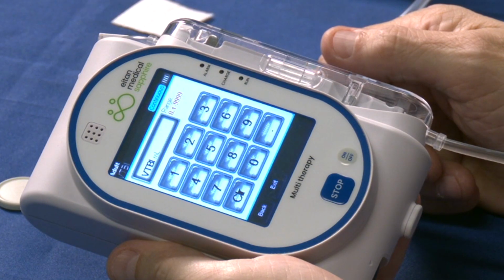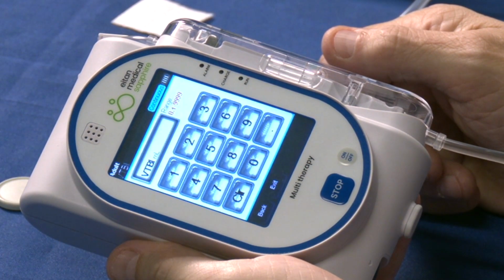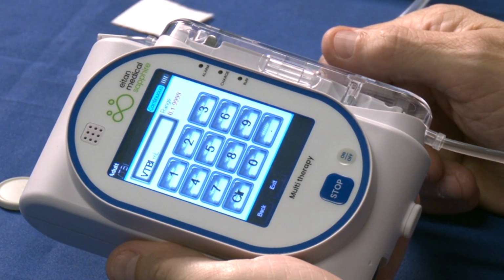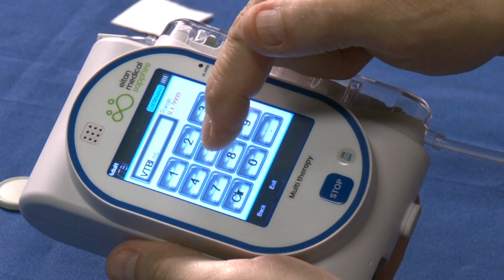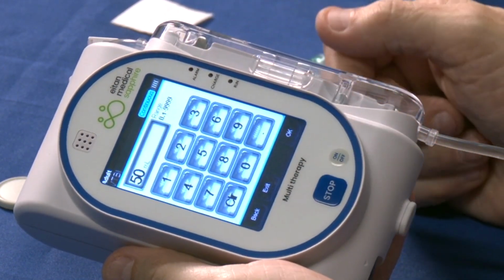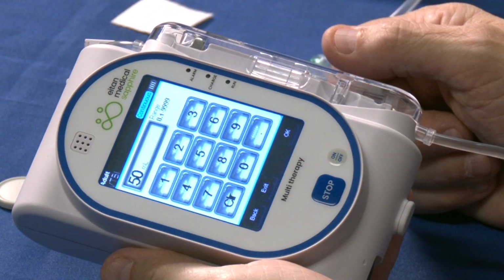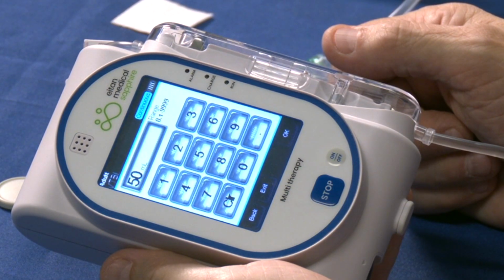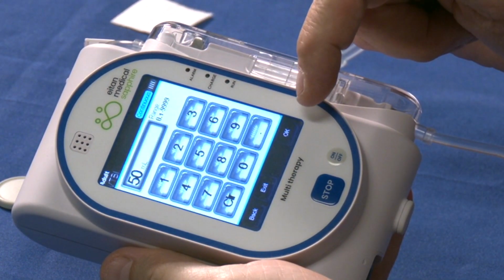Per protocol, we need to change to infuse half of a gram. To do this, we will type in 50. This will tell the pump to only infuse half of the volume, giving us our required half of a gram dosage. If our patient requires a second half of a gram, we can later infuse it and still be under Maryland Medical Protocol. Select OK.